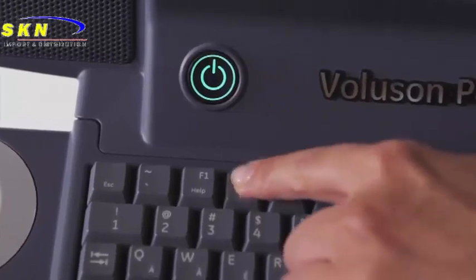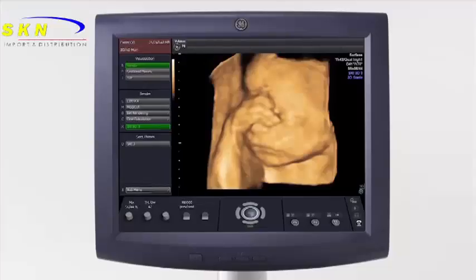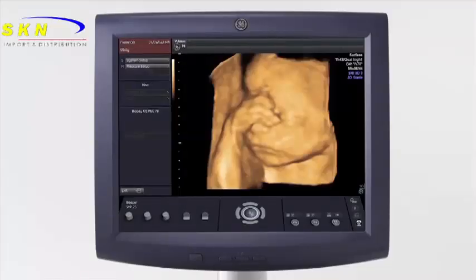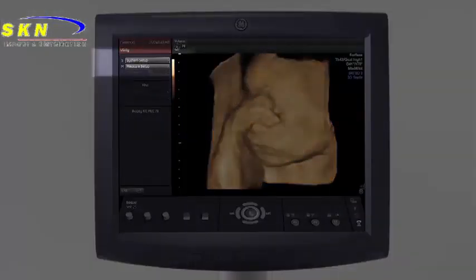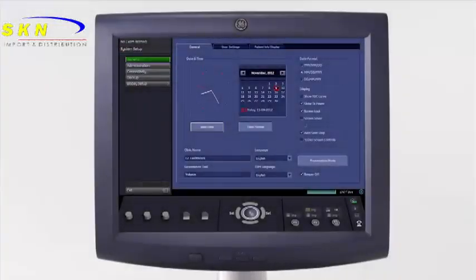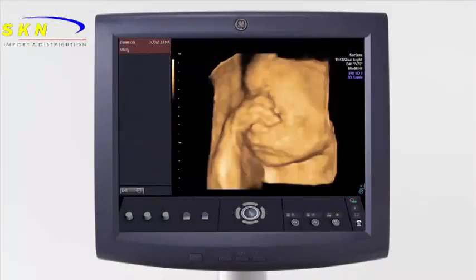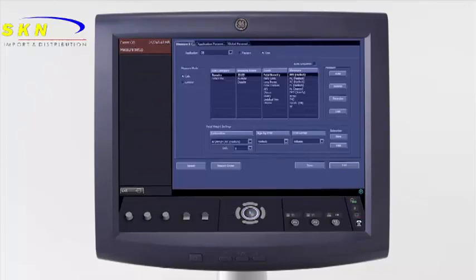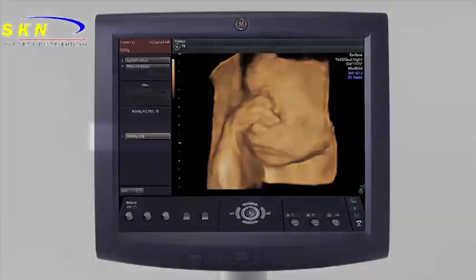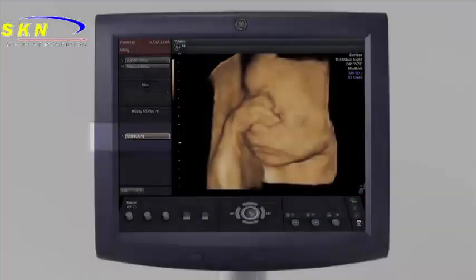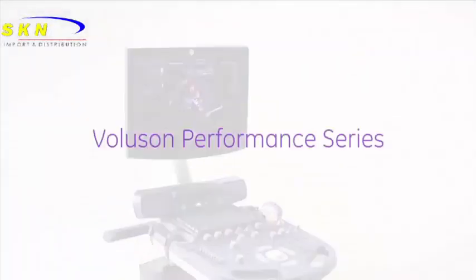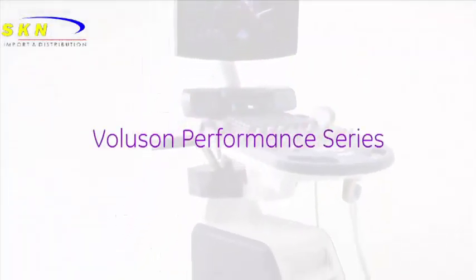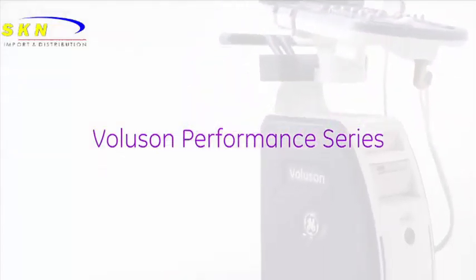The utility key on the alphanumeric keyboard will bring up options on the display menu. To customize items such as annotations library, presets, print keys, and any other configurations, select System. To customize the measurement packages and options, select Measure. The utility menu is also where biopsy lines can be activated. The Voluson Performance Series is an easy-to-use system with excellent image quality and performance to help meet the needs of your practice.